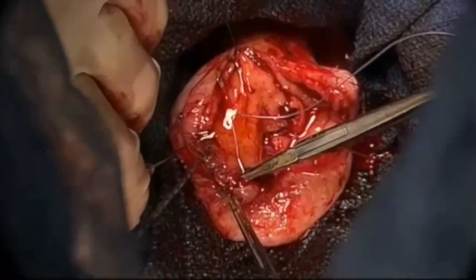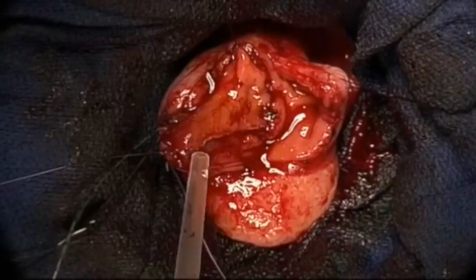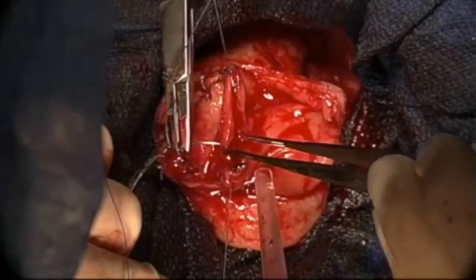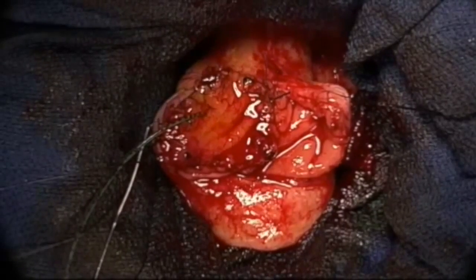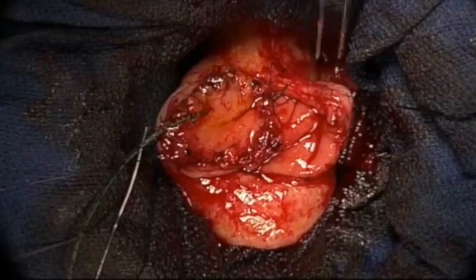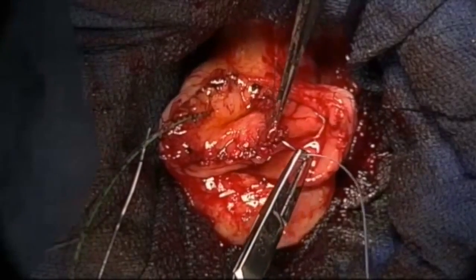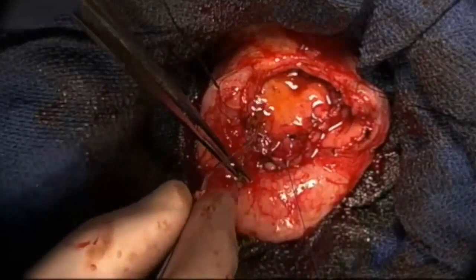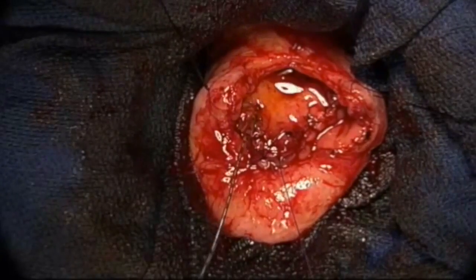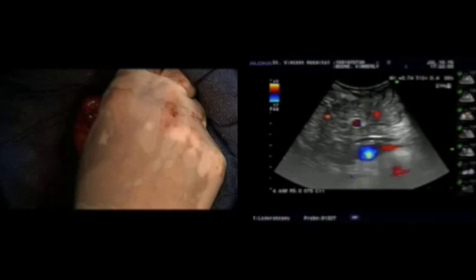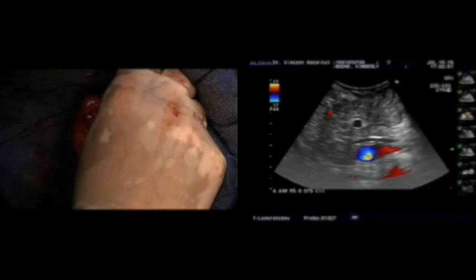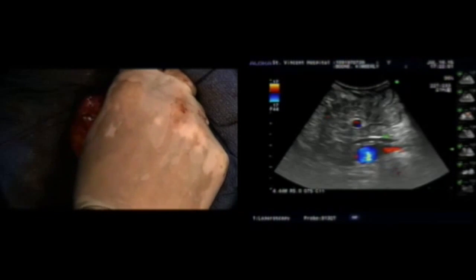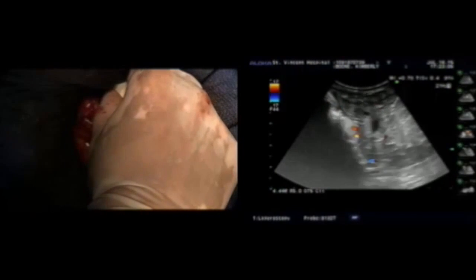Our patient had a quite similar anatomy. This video presents the surgical procedure performed for a 41-year-old woman diagnosed with a duodenal cyst obstructing the lumen. The cyst was temporarily decompressed by endoscopic ultrasound-guided aspiration. The patient later underwent open transduodenal cystectomy with internal marsupialization along with cholecystectomy. Intraoperatively, the major papilla was found located within the cyst cavity, appearing to drain into the cyst. No other communication between the cyst and the duodenal lumen was found, and drainage appeared to be provided via a dorsal accessory duct. The pathology was consistent with duodenal duplication cyst, and she had an uncomplicated post-operative course.